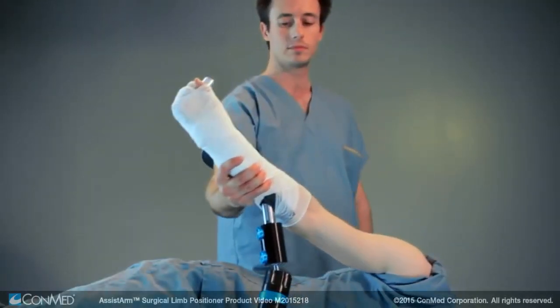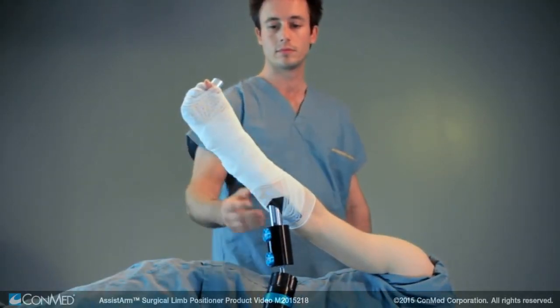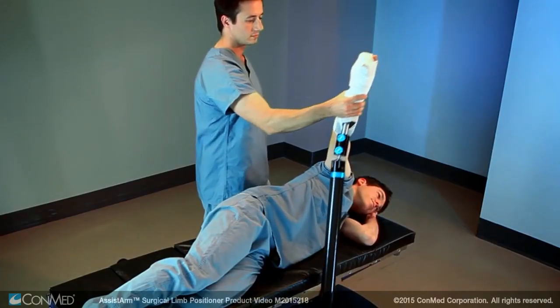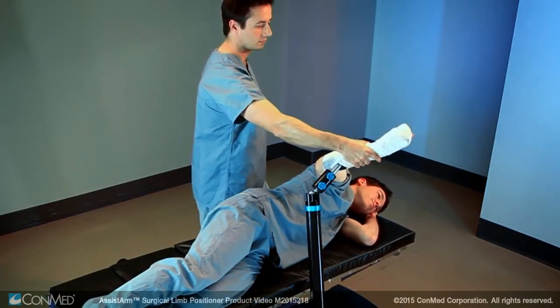The lightweight yet sturdy Assist Arm allows the limb to be moved using only one hand, making arm positioning much easier during lateral decubitus procedures.